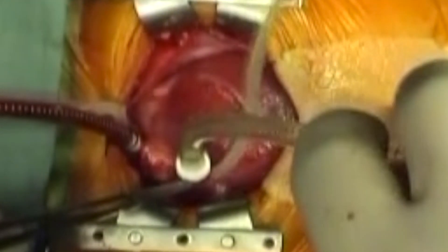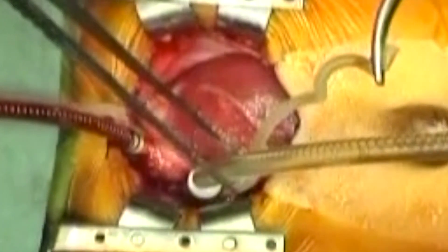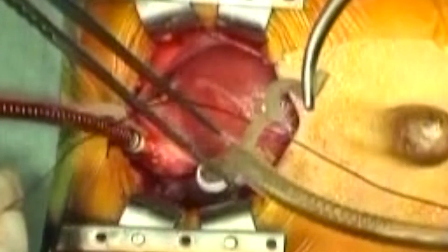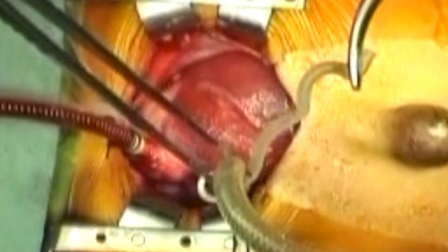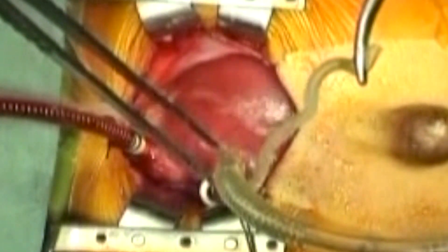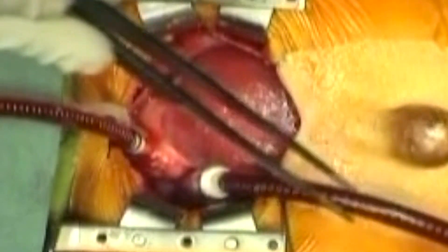The purse string is snared down over the end of the cannula and then the cannula and the snugger are tied together. Off screen to the right, the cannula is connected to the venous limb of the cardiopulmonary bypass circuit. The clamp is removed and cardiopulmonary bypass is commenced.